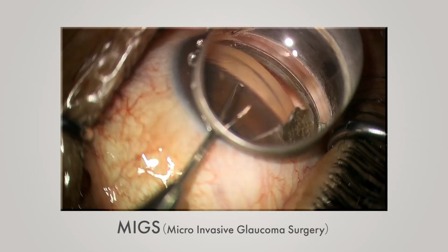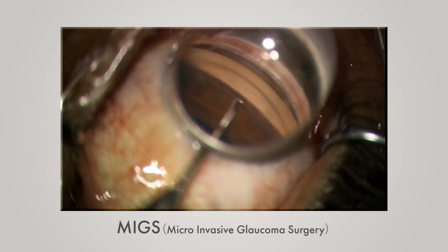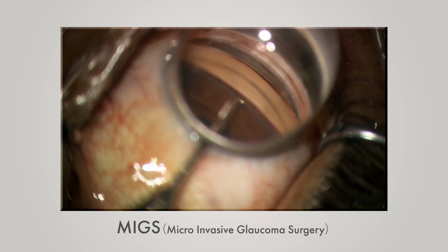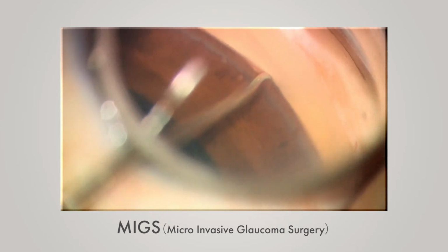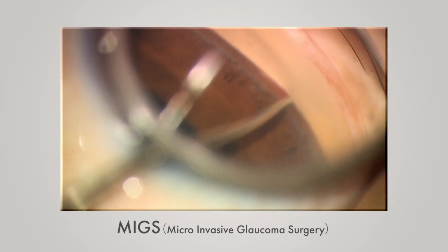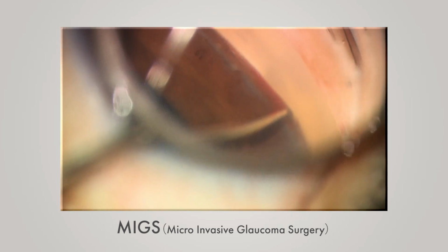Micro-invasive glaucoma surgery is a recent surgical technique for reducing the IOP for glaucoma patients with mild to moderate symptoms, due to its much lower burden on the eye and shorter operating times with far fewer complications. This technique is widely praised.